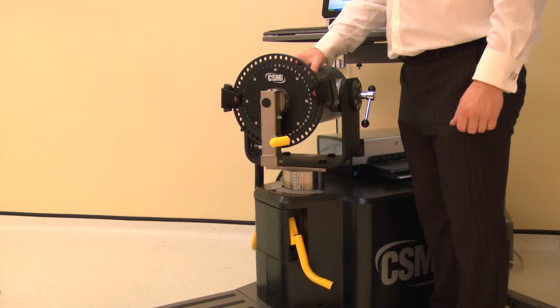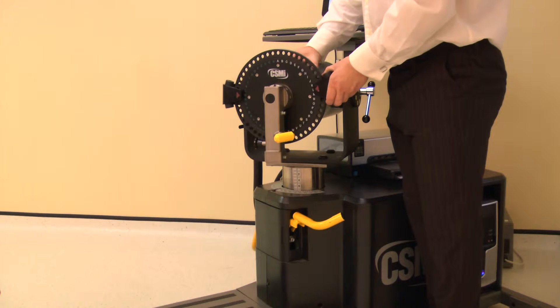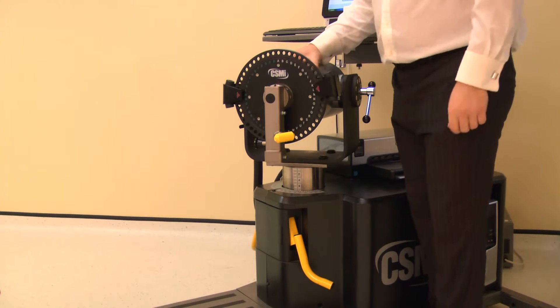The dynamometer height and rotation are adjusted together. Lift the locking handle to release. Rotate the dynamometer to 5 degrees on the green scale, whilst also adjusting the height to position 9. Ensure both locking handles are pushed down to secure.